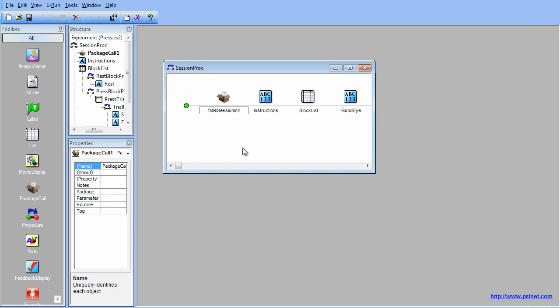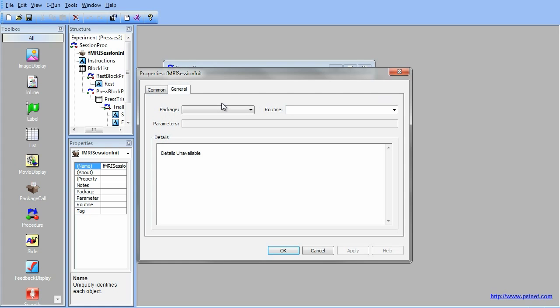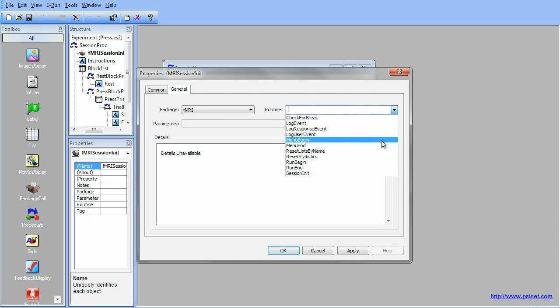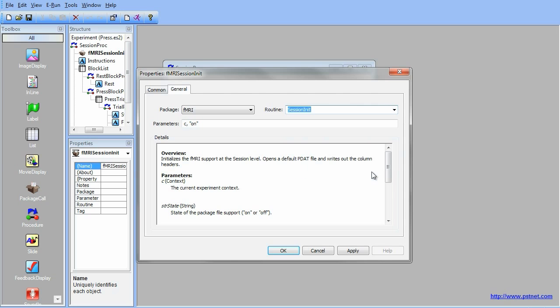Changing the name of an Experiment Object is done either by changing the name on the Experiment Object Properties page, or by pressing F2 when the object is highlighted. Open the Package Call Properties page by double-clicking on the Package Call. Change the Package drop-down box to fMRI and the Routine drop-down box to Session Init. This package call turns on the fMRI support and creates a pDAT file as output. Click OK to accept the changes.